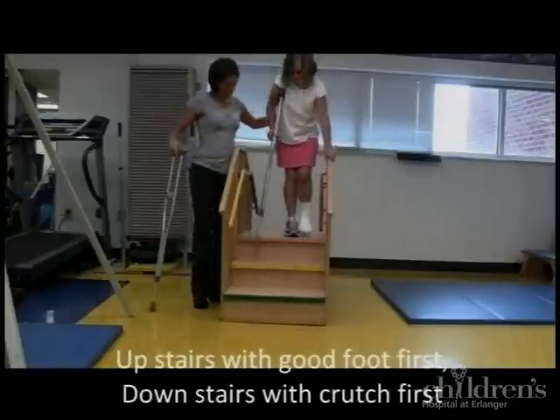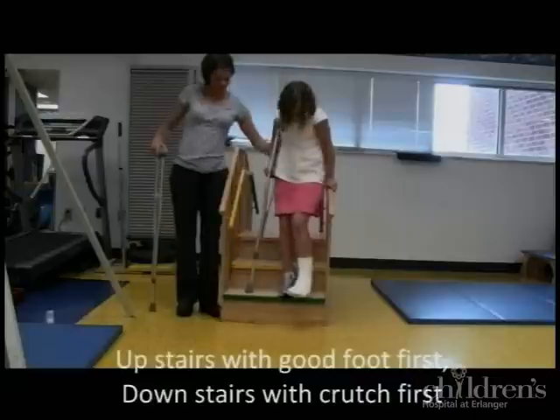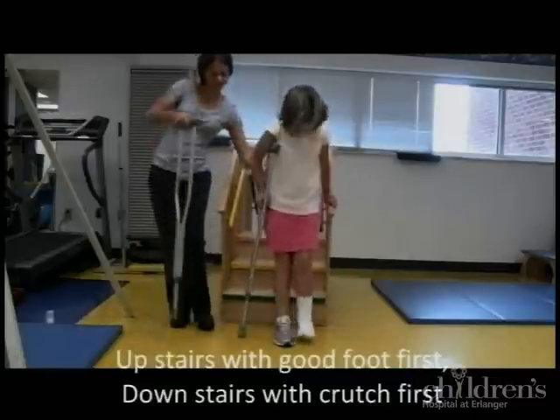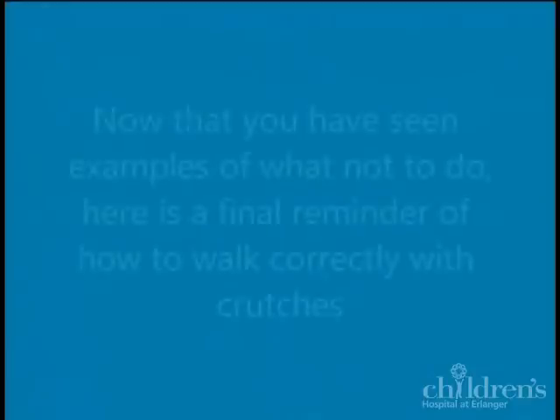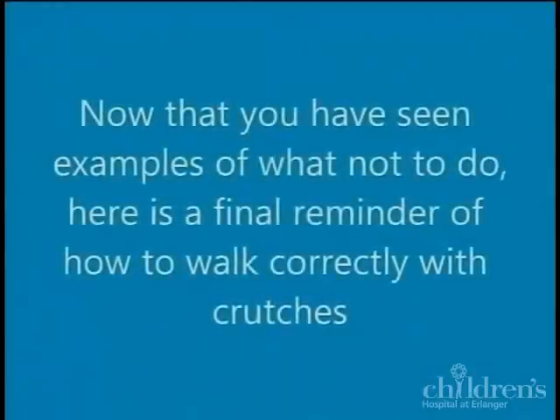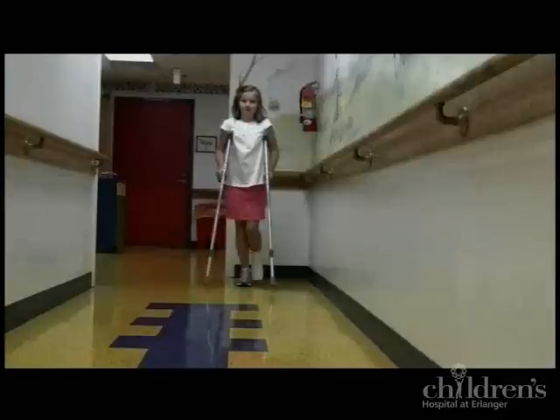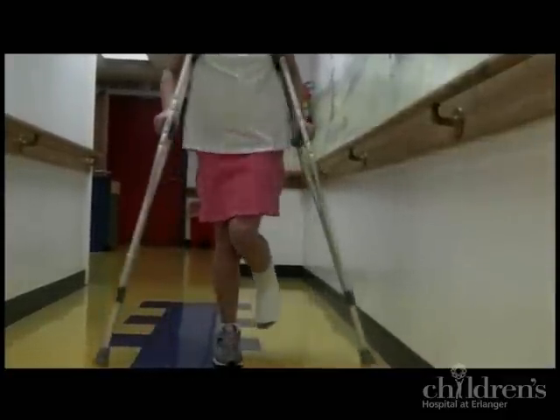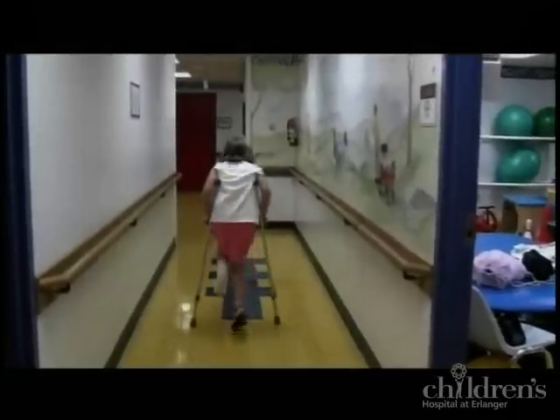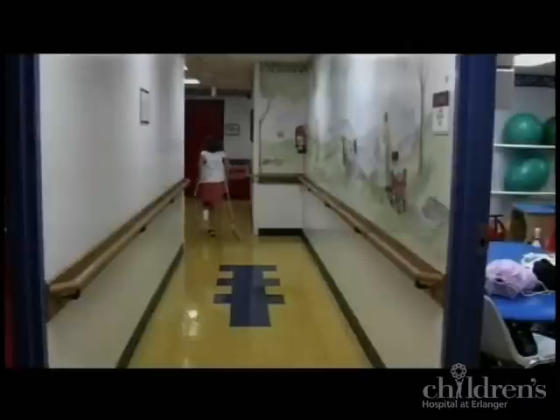When going down the stairs, have your child lead with the crutches first. Have your child move both crutches six to eight inches in front of them at the same time, and then advance the non-injured foot past the crutches. Make sure your child does not swing the injured foot too far out in front of them, as this can cause a fall.